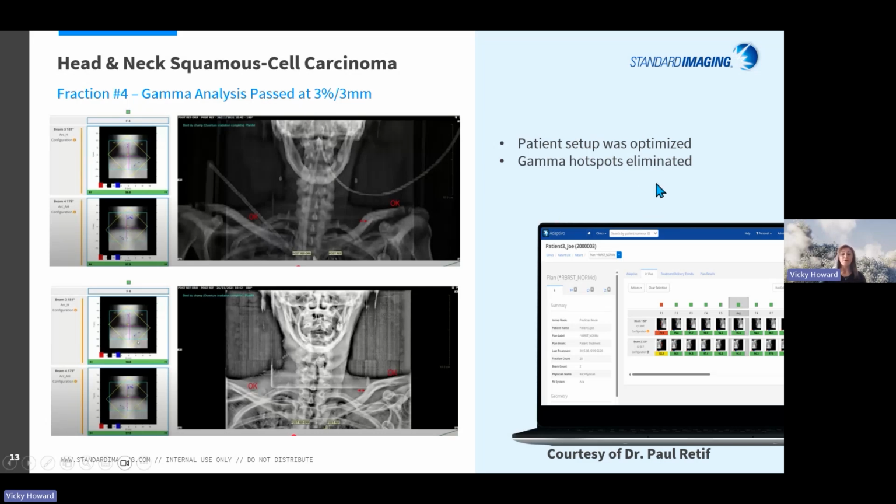So this is a wonderful tool that clinicians can use to ensure patient setup is optimized. The power of data and information here really does make staff want to rise to the challenge and ensure that their setups are highly accurate. This is also a wonderful tool if you're introducing any sort of new immobilization device or setup for a particular patient that's different. It really gives you the eyes on each daily fraction that is needed to assess that.